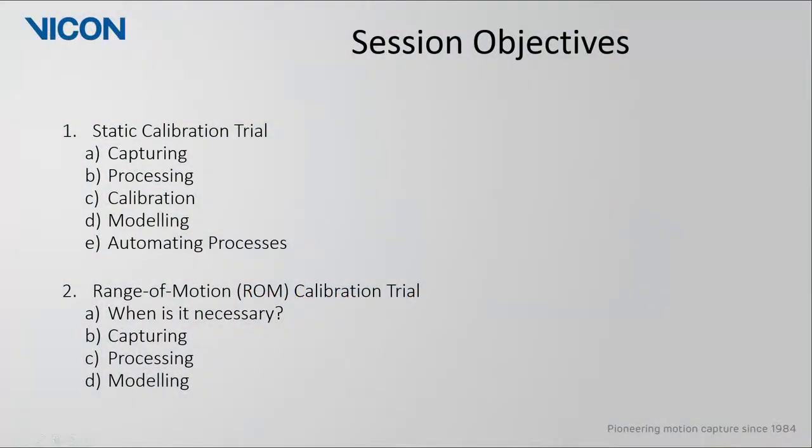In this guide, we will look at the workflow for two different types of calibration trials. The first type is the more traditional static calibration trial, while the second type is for a range of motion or ROM trial.